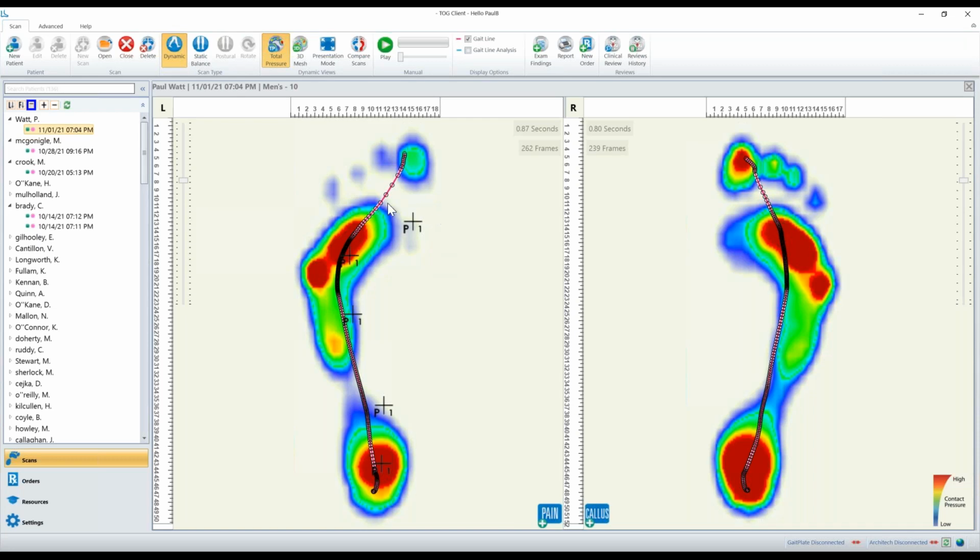And previous to coming into my clinic, they had been issued an orthotic with a first metatarsal cutout to try to encourage the big toe to bend. The only thing that will encourage this big toe to bend is a hammer and chisel, unfortunately. So when the big toe doesn't bend, then we have to put note of that in the examination findings, and we have to make sure that we manufacture the orthotic effectively.